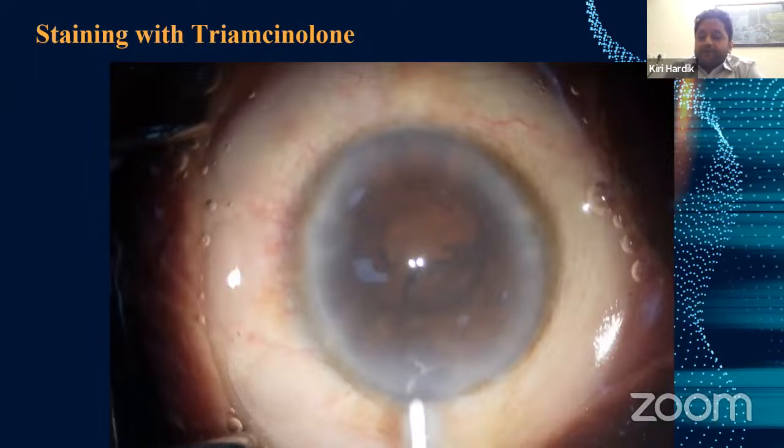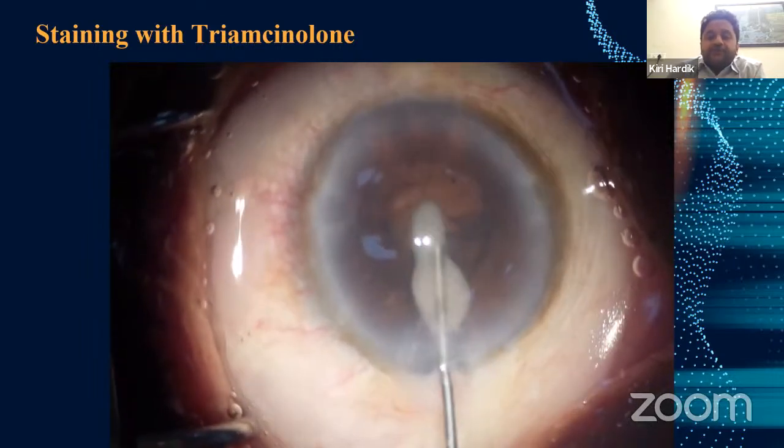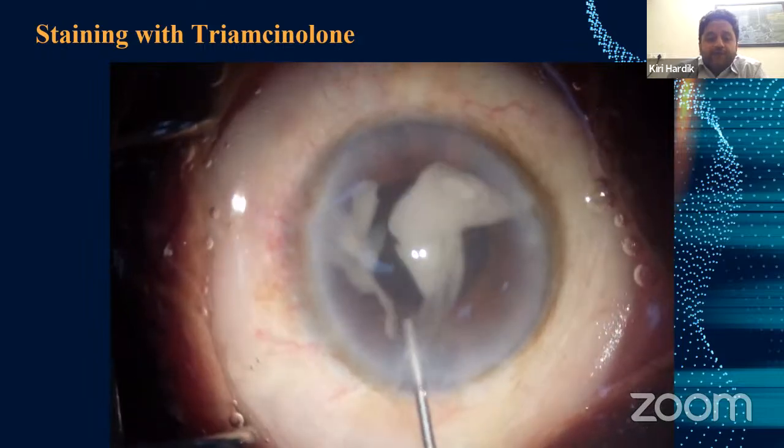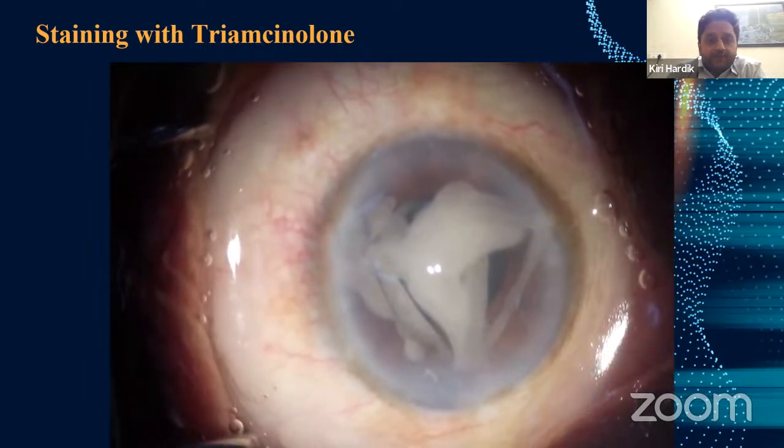Till now, we have learned what the signs are to identify the PCR, and once you have identified the PCR, what the next steps you should do. And now we will see what techniques are available to do the anterior vitrectomy. Once you have noticed that there is a PCR, it is always better to stain it with triamcinolone. Triamcinolone usually stains the vitreous fibers, and it will attach to those fibers and it will not move. So it will give you better visualization of these things.